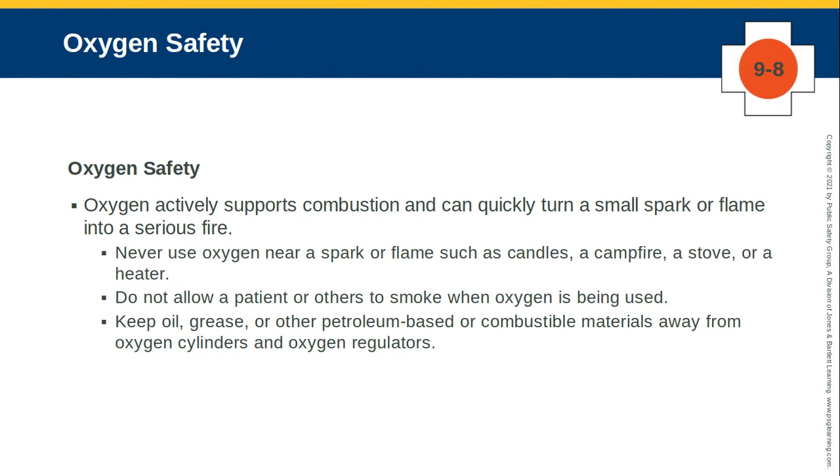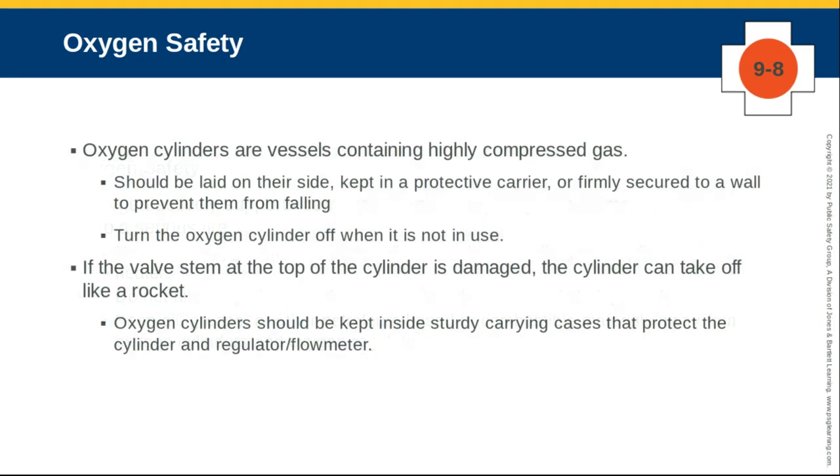The other thing to consider is compressed cylinder safety. So that cylinder should be laid on its side when you're working a scene, or inside the padded case that they typically come in inside a trauma pack. In a first aid room or a clinic, they're typically secured to a wall with chain or some other sort of a structure, perhaps a case.